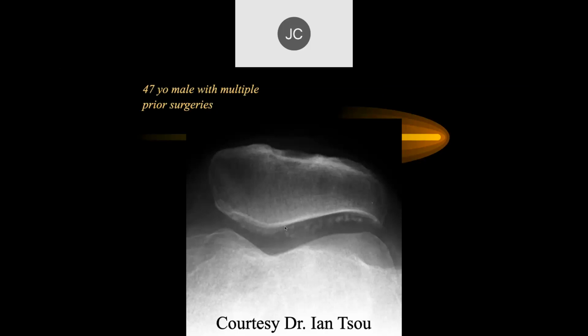Okay, any questions? So, there's a lot of times that we get a pre and post contrast in the MRI, for example. Should we ever be looking at the post contrast and making a note that there is some increased enhancement within those cartilages, even with an intact overlying surface? Yeah, I think you should. Okay.